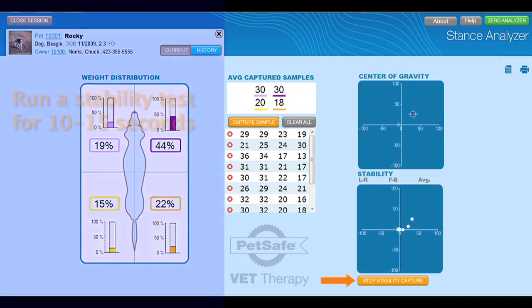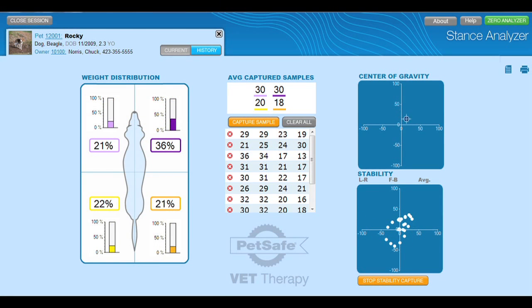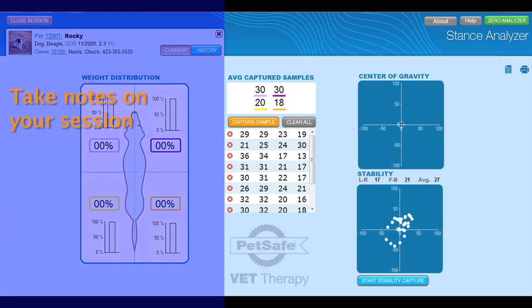On the right-hand side of the screen, we have the stability test center. The top box gives you a real-time view of where the patient's center of gravity lies. Once you start a stability test by pressing the button or pressing 2 on your handheld remote, the Stance Analyzer will begin to collect data on the patient's center of gravity. The collection stops when you press the button or 2 on the remote. If you have any notes you'd like to take about this particular session, simply click the notes icon. You can also print this screen for your records or to give to your clients.